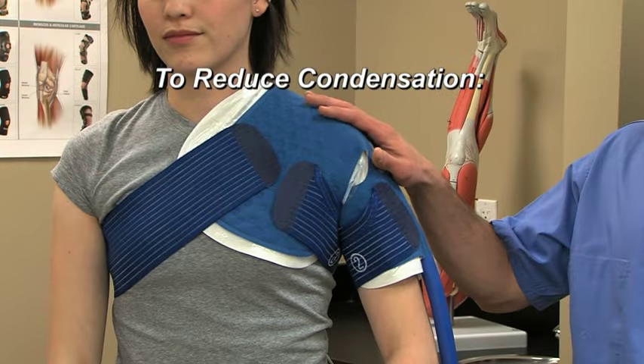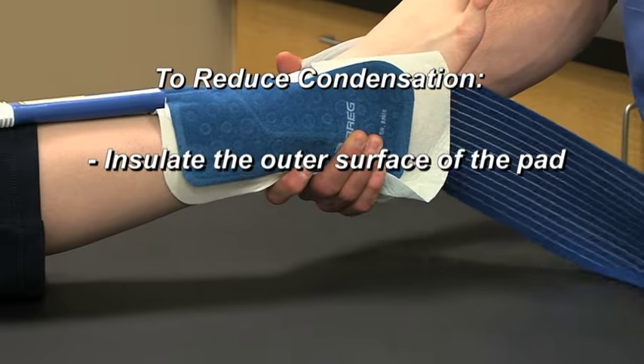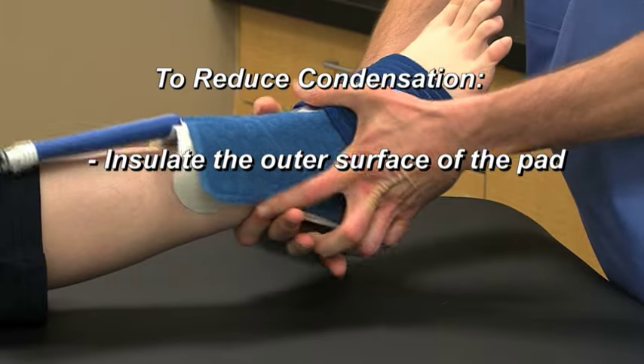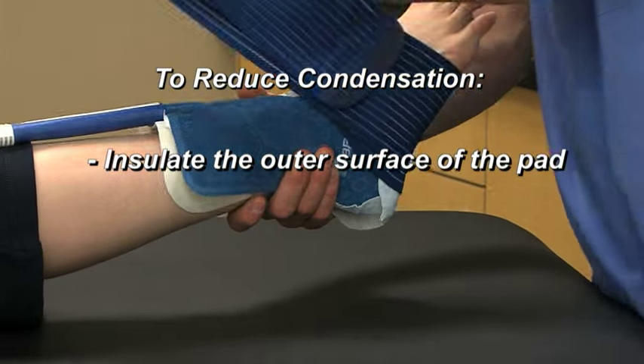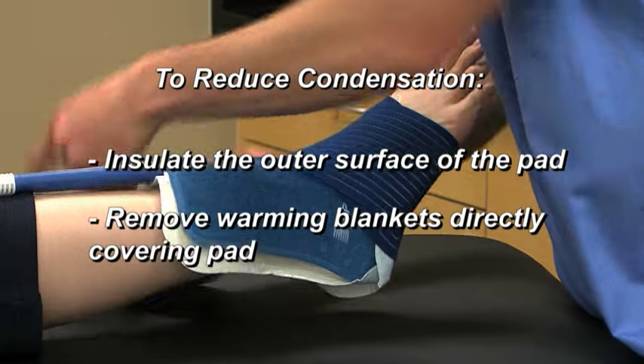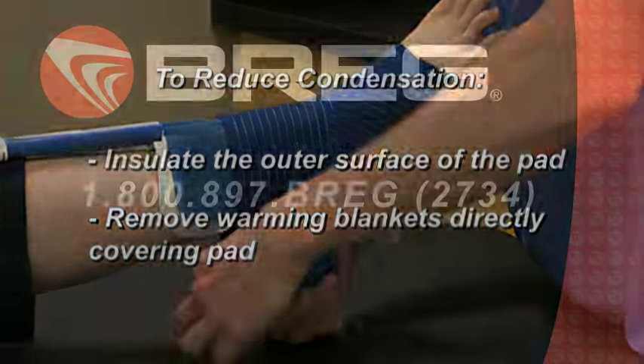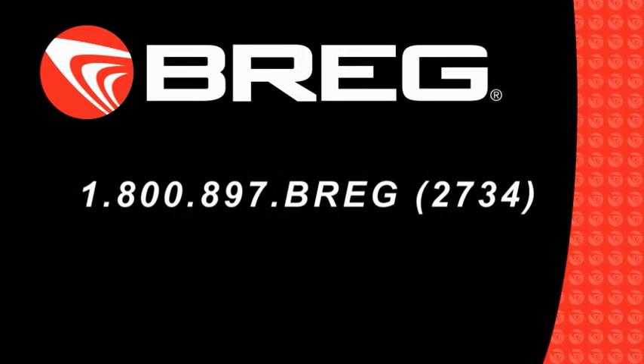If excess condensation appears on the surface of the pad, wrap the outer surface with an ACE bandage or similar material to prevent warm, humid air from coming into contact with the pad. Also, remove any warming blanket that traps warm, humid air above the surface of the pad. If you're unable to resolve an issue using the steps within this video, don't hesitate to contact your local Breg sales representative or Breg Customer Care at 1-800-897-BREG. That's 1-800-897-2734.